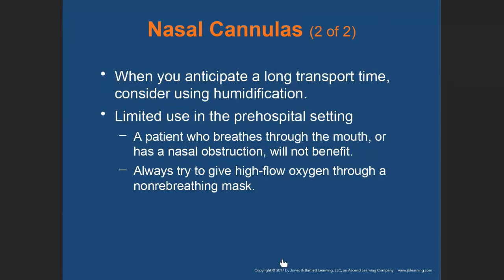When you anticipate a long transport time, consider using humidification. Humidification is necessary to make the oxygen moist and easily absorbed. We will use humidification for patients who need oxygen with a history of upper or lower respiratory tract infections. Patients with infections tend to get dehydrated, so if you give them dry oxygen, they might have issues absorbing it. The humidifier helps to moisten the oxygen so they can breathe it in better.